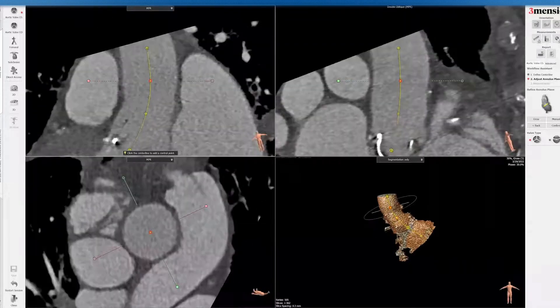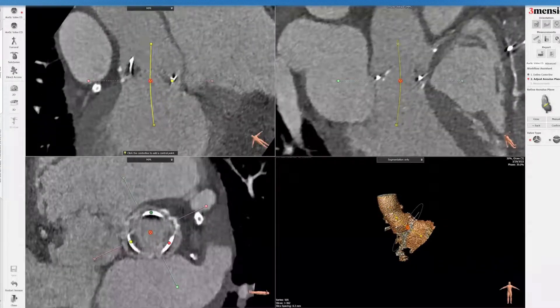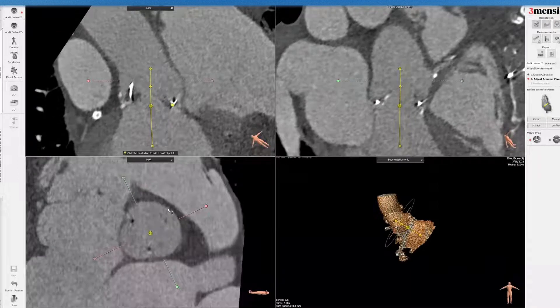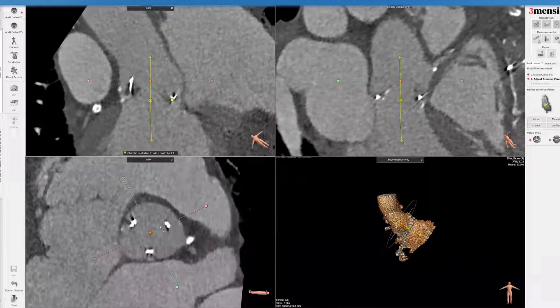Next we're going to try to streamline the centerline. I deleted some dots here because one thing you have to be mindful of is that the surgical valve may be a little canted versus the aortic root. You want to make sure you align the centerline off the surgical valve itself. The three commissural poles should disappear, showing that you're in the centerline measurements, and you want to be just high enough to show you're above the corners. This is a centerline to the surgical valve, not to the aorta.